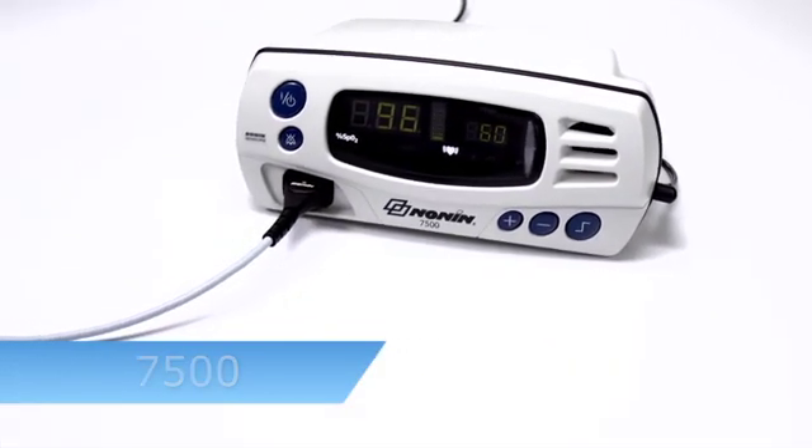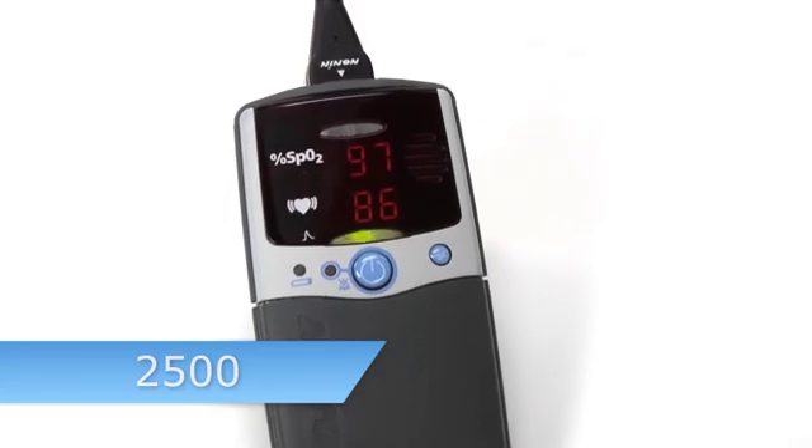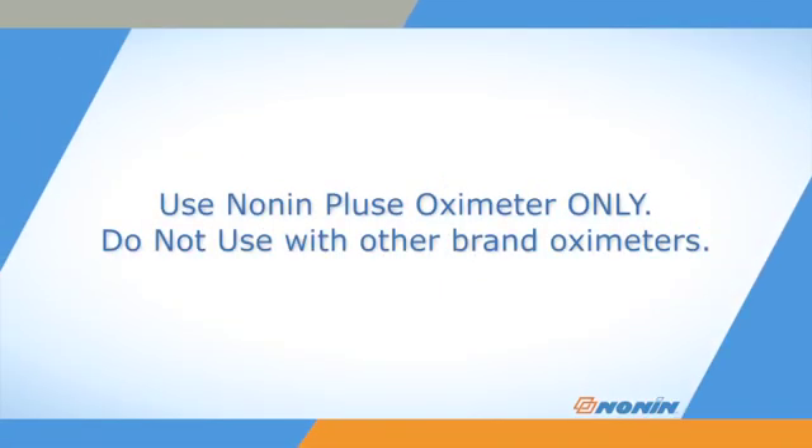The 8000R forehead sensor is designed for use with a wide range of NONN pulse oximeters. Remember, NONN sensors are designed for use with NONN brand pulse oximeters only. Do not use the sensor with other brand pulse oximeters, which may provide inaccurate results.